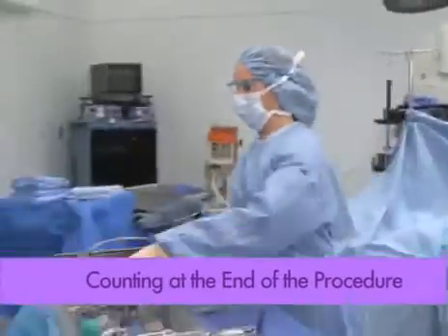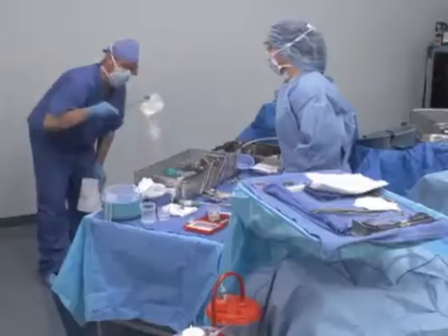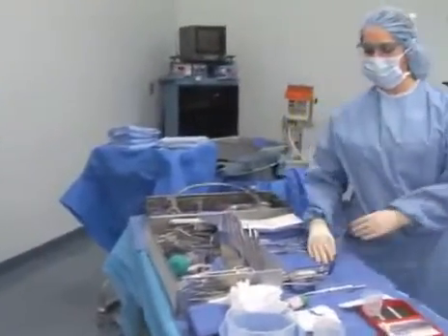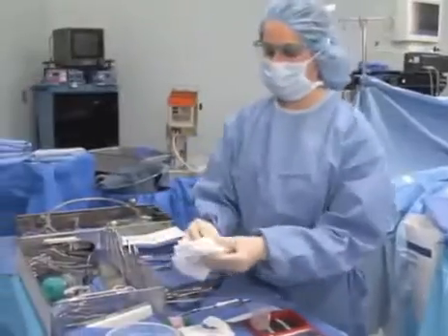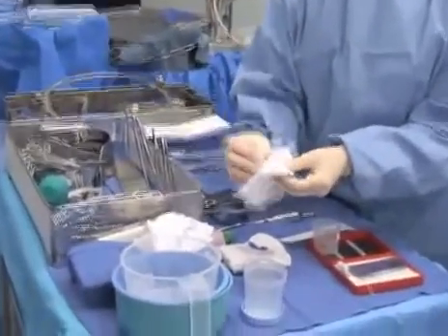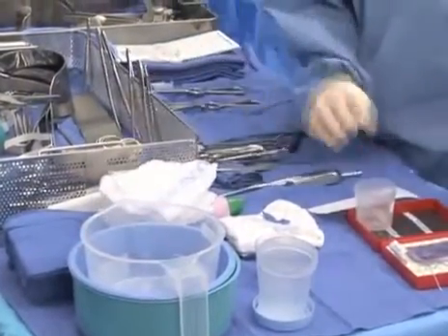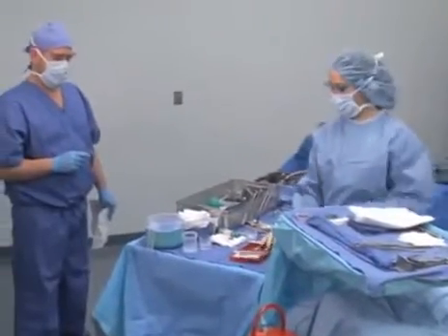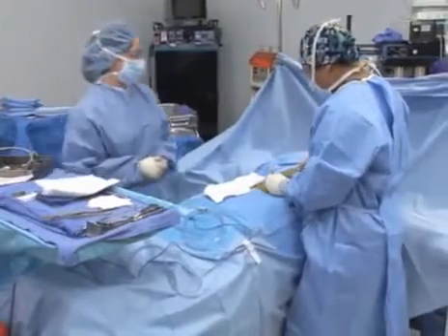Would you like to do a count? Lap sponges: 1, 2, 3, 4, 5. Raytech: 1, 2, 3, 4, 5, 6, 7, 8, 9, 10. Needles: 1, 2, 3, 4, 5. And blades: 1, 2, 3, 4. Your count is correct. Thank you.